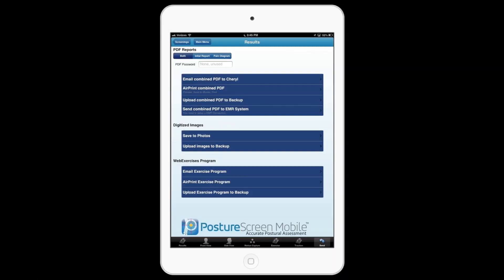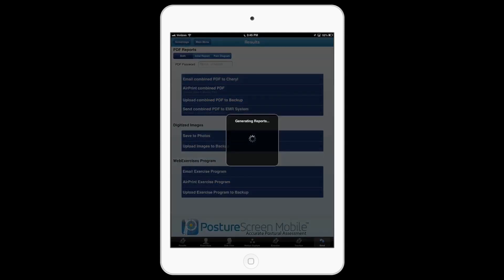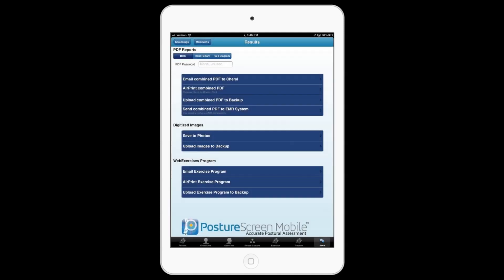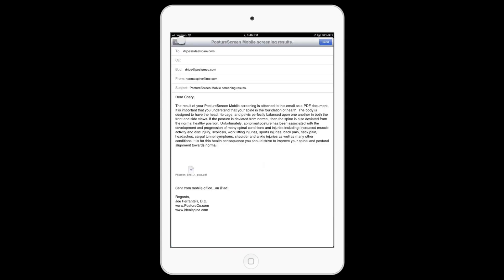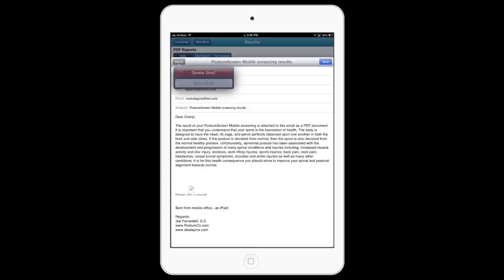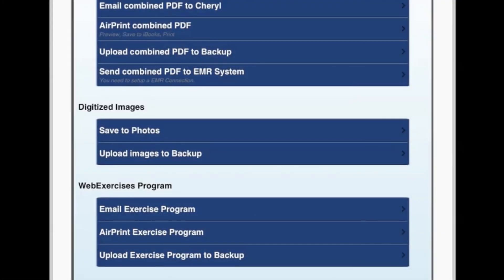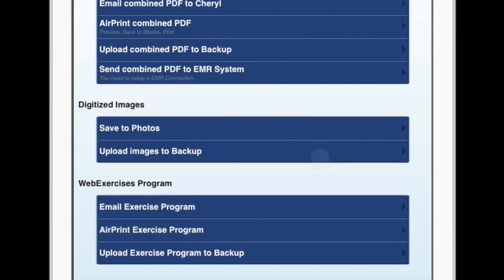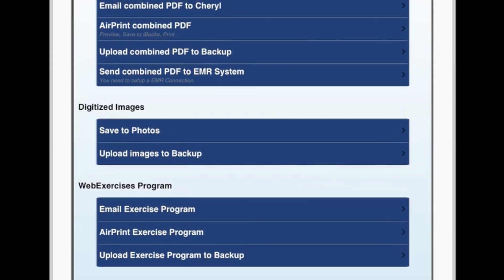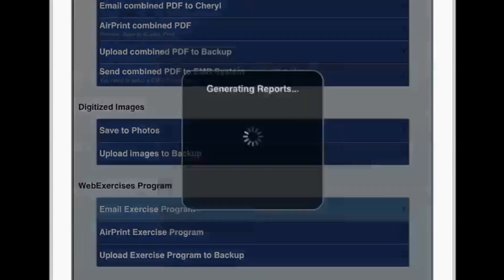Moving along, if I wanted to send this to the patient, I could go ahead and email to the patient or the client. Securely, I can password protect the email if I wanted to. I want to focus on exercise, so we come down to the bottom and I'm going to say 'email exercise program'.